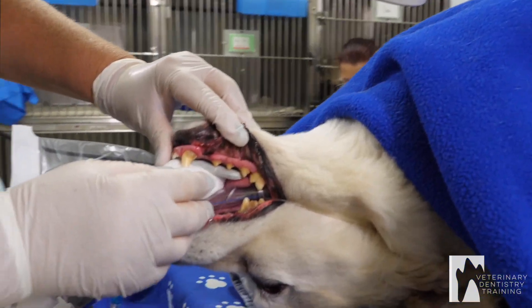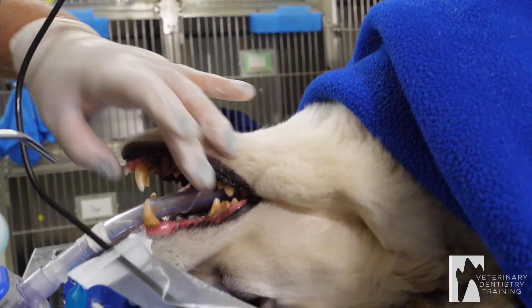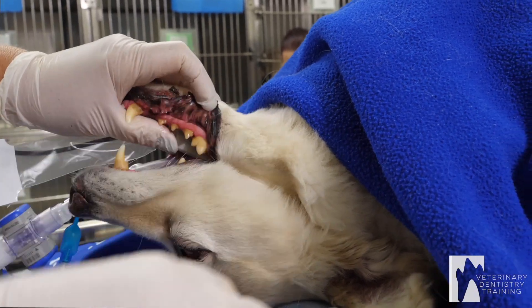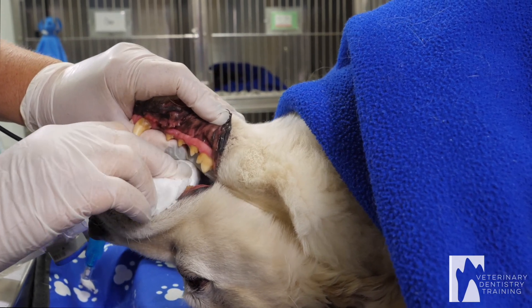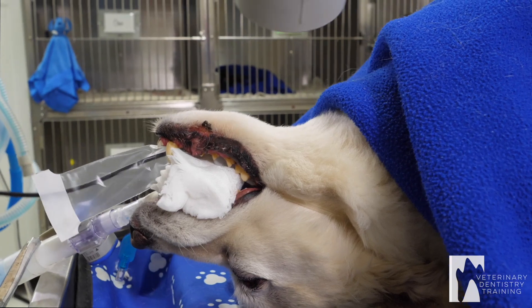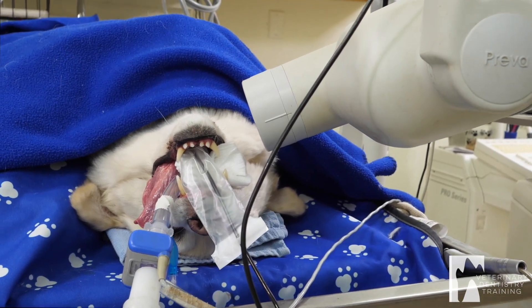Now I'm going to do the fourth premolar. Move his tongue to the side. I grab my water — just a tiny bit of water so this slides in. It's parallel to the roots like that. I hold it in and then I take my gauze right here — keeps it down. It's just parallel to the root, and then I come in at a parallel shot. This angle is parallel to the jaw, centering on the root of the fourth premolar. X-ray.